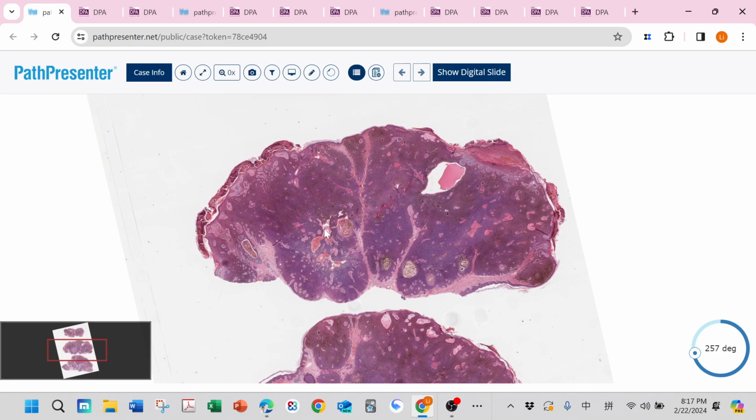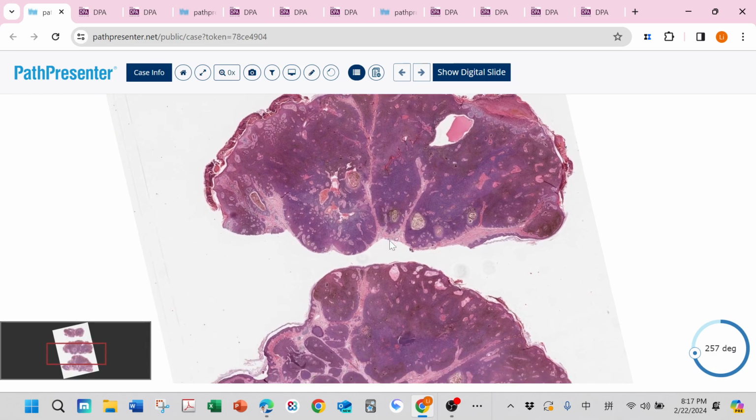This one is an old name of this diagnosis. And the name of this one is acrospiroma. I don't even remember I ever made this diagnosis. This is an old term to include poroma, which is the one we talked about previously, and also hidradenoma. And this one kind of combines two of these entities.